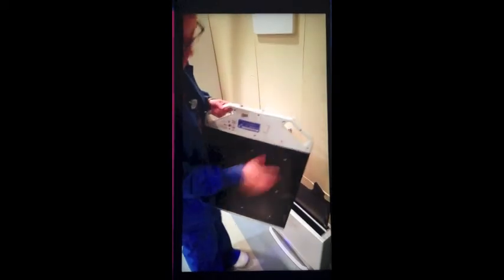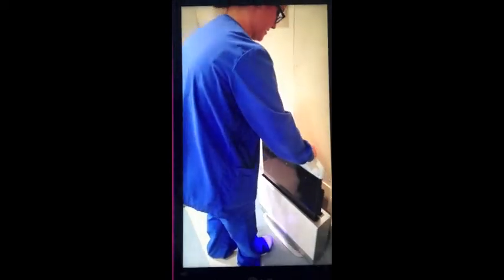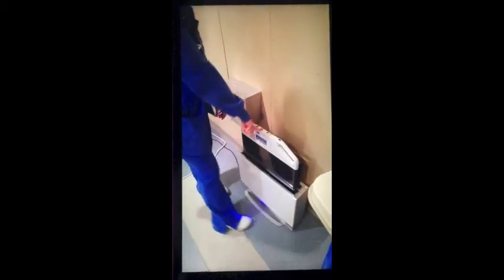And then when you go to charge your cassette, you want to make sure that you have your notches pointing out this way and you have a green light at the top.